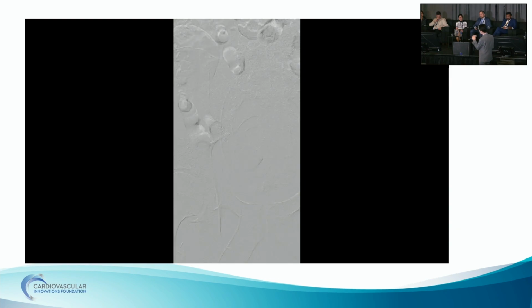Just because we knew this particular graft was 8 millimeter in size, and given that we're doing open access to begin with, naturally you want to use as big a catheter as possible to get the most thrombus out. Because this is a surgical bypass conduit, we can be quite aggressive. After opening the distal thigh for access, you can really be aggressive with the catheter. You want to be quick because this is quite a large catheter, and you can have significant blood loss, which can make anesthesia quite nervous.